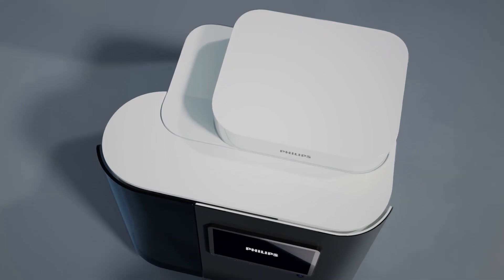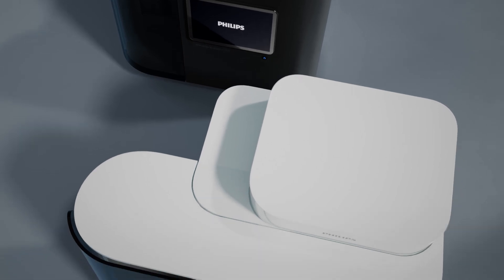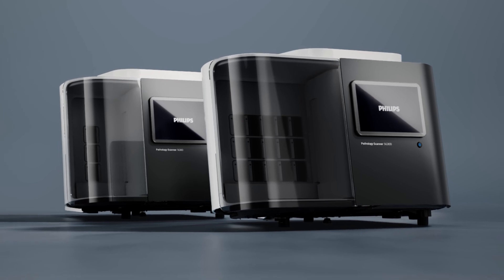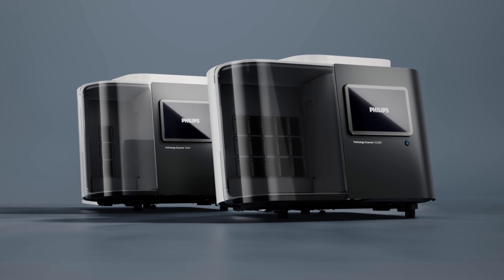Since all Philips SG scanners share the same DNA, you can count on superb quality images and exceptional scanning experience, and a digital pathology network designed around your laboratory's needs to help accelerate the path from images to answers.